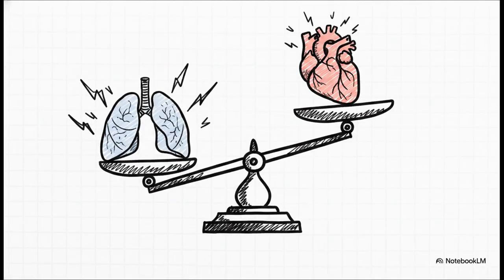But pushing pressurized air into the chest cavity isn't exactly a natural physiological state, and it comes with a hidden cost. It drastically increases intrathoracic pressure. This can decrease venous return to the heart, drop cardiac output, and just tank a patient's blood pressure. It can also spike pulmonary vascular resistance and cause a VQ mismatch in the lungs. So managing a ventilator isn't just a lung game. ICU staff have to meticulously manage the heart and the cardiovascular system right alongside it.